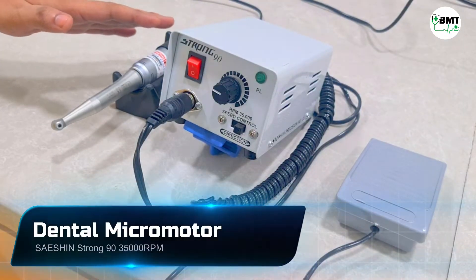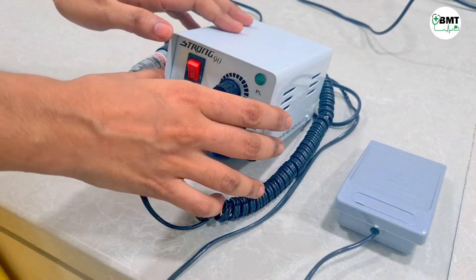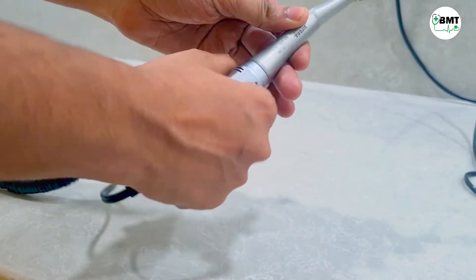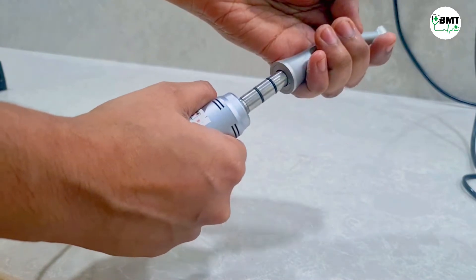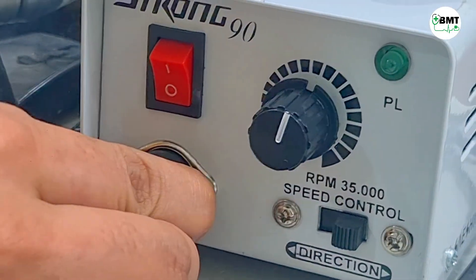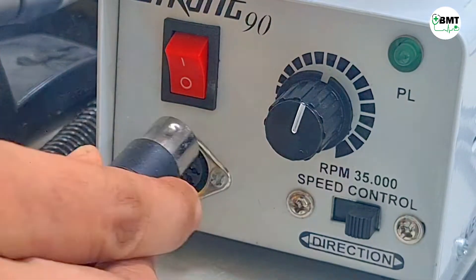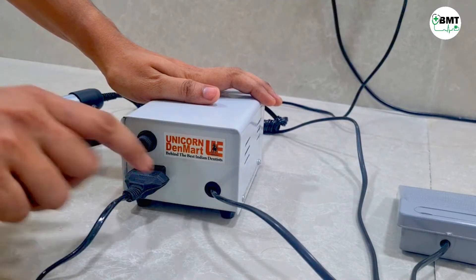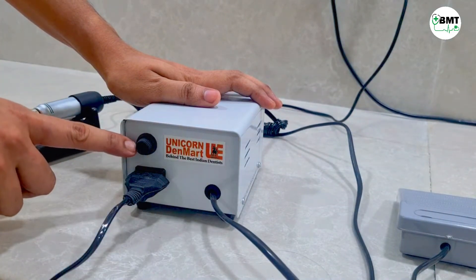This is the micromotor drilling device used during root canal. This is the main console, this is the handpiece, and this is the foot switch. To remove the handpiece, hold it here. When connecting and disconnecting the handpiece cable, there are only three pins — connecting requires a press. On the backside, this is the foot switch power cable, this is the mains power cable, and here is the fuse.